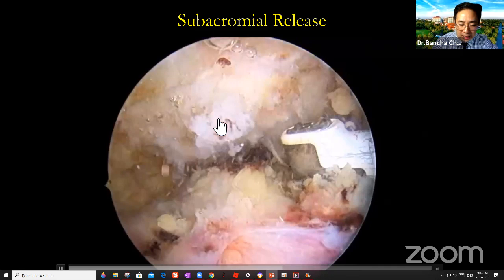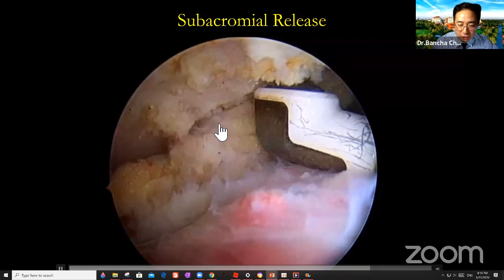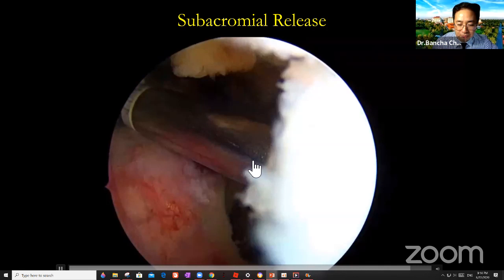So I think cleaning is important. I spend a lot of time cleaning to get a better view and stop the bleeding. Cleaning the roof that way, before starting to do any surgery.